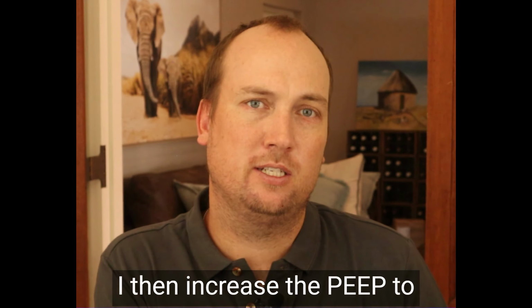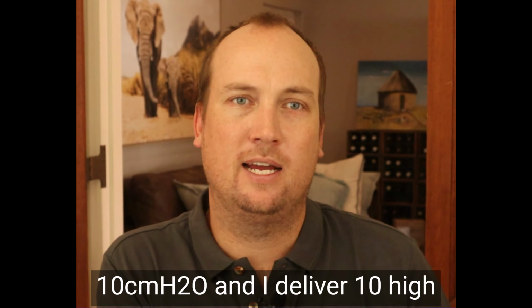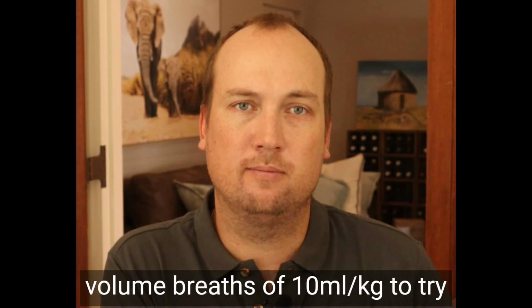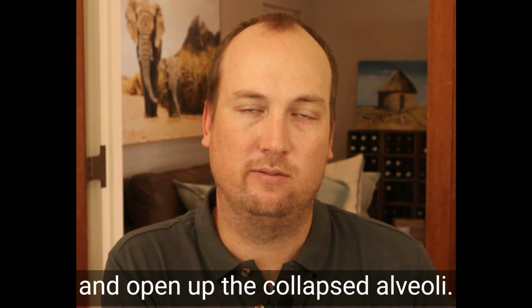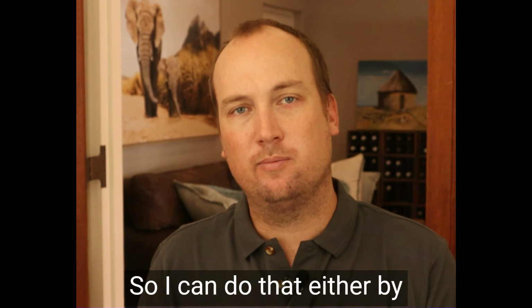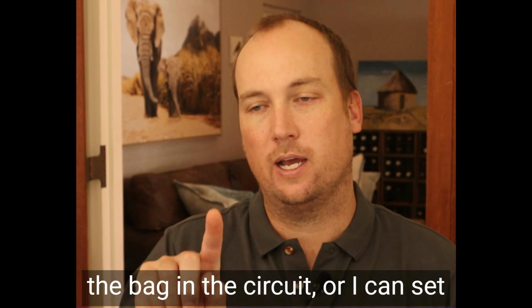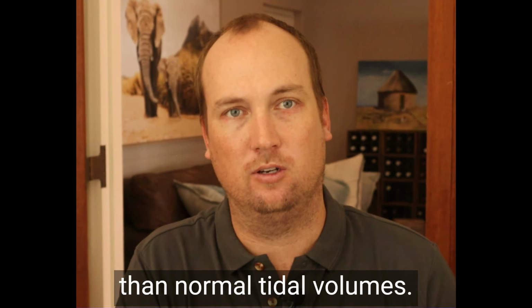I then increase the PEEP to 10 centimeters of water, and I deliver 10 high volume breaths of 10 mils per kilogram to try and open up the collapsed alveoli. So I can do that either by delivering manual breaths with the bag in the circuit, or I can set my ventilator to deliver higher than normal tidal volumes.